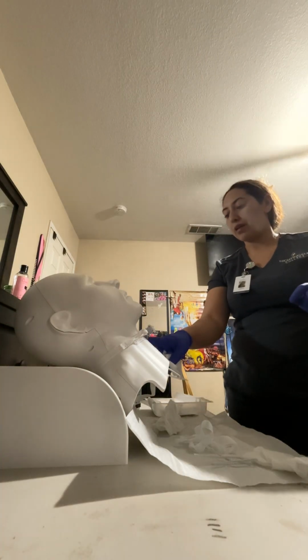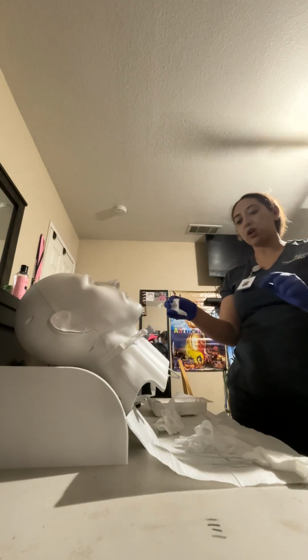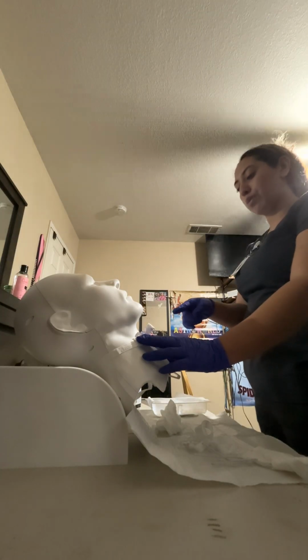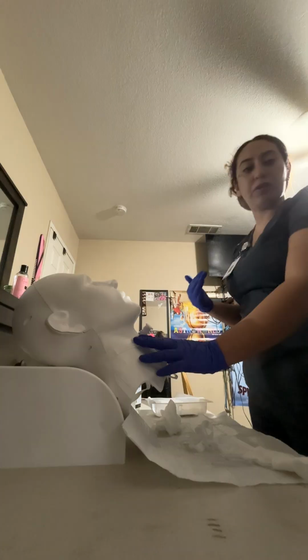So for this portion, I will need a second set of hands. So I'm going to have my coworker come in, clean their hands, and apply PPE. They are going to hold down the side of your trach ties while I remove one side at a time. The reason that we use 2 persons to do this step is to prevent dislodgement of the tracheostomy. Okay, for this video, I will use my second hand to do that, but if this was a real scenario, I would have my second person come in and help me with this part.